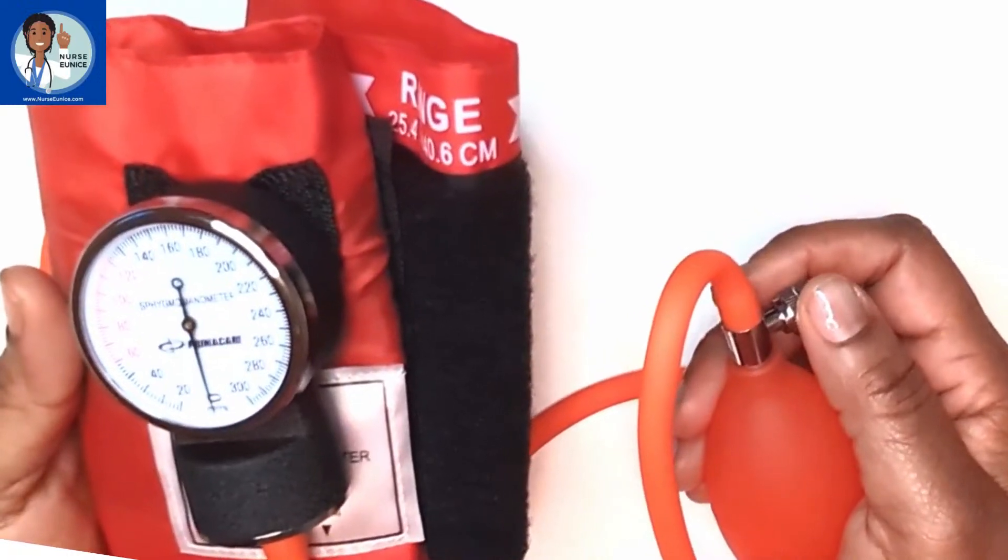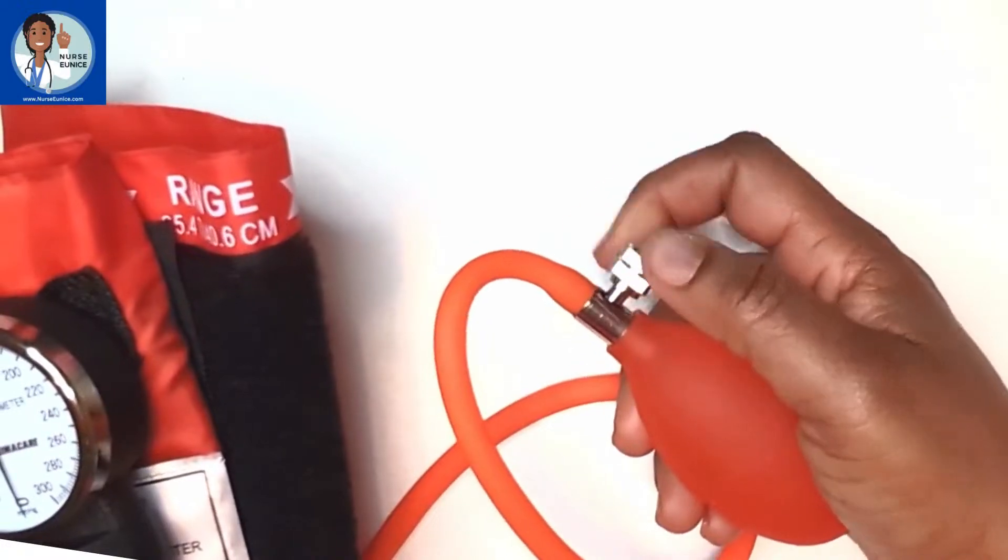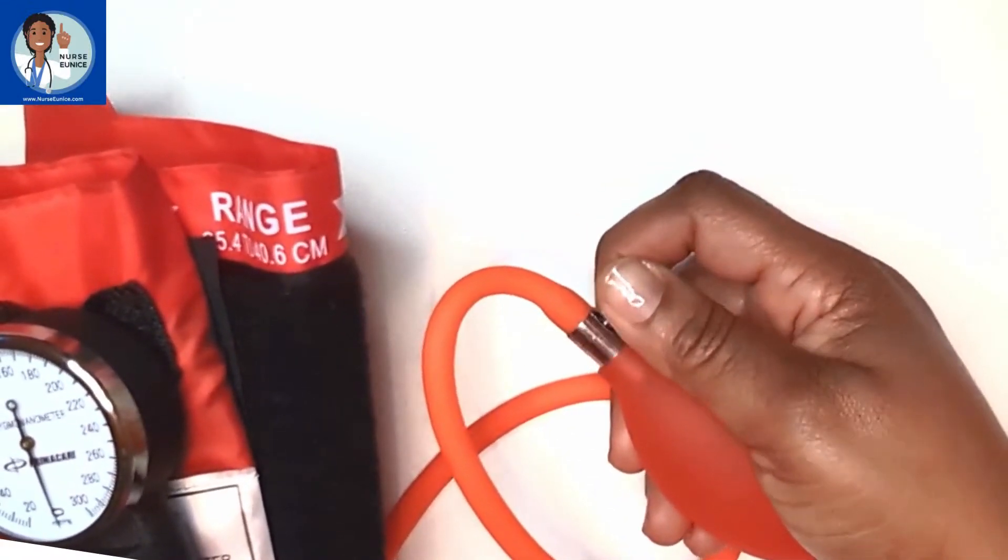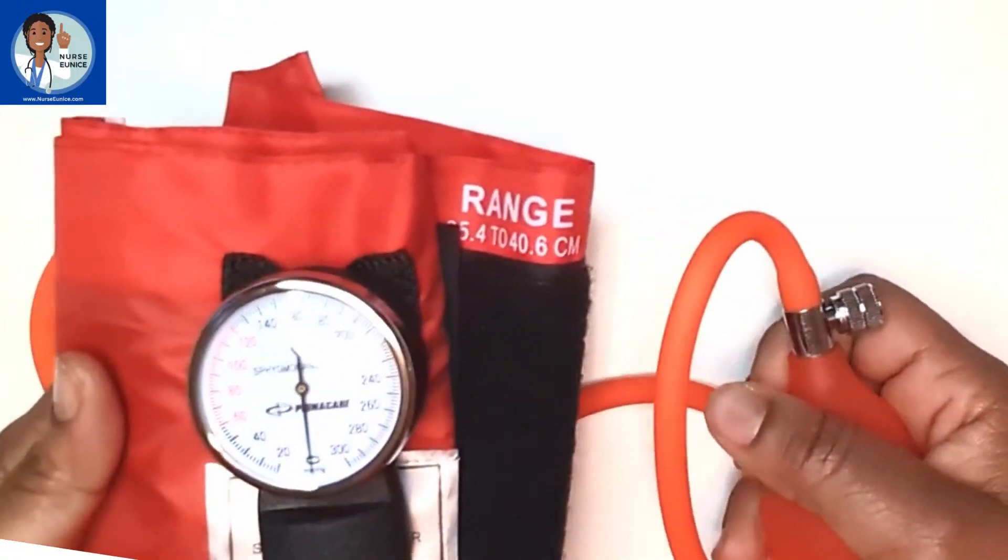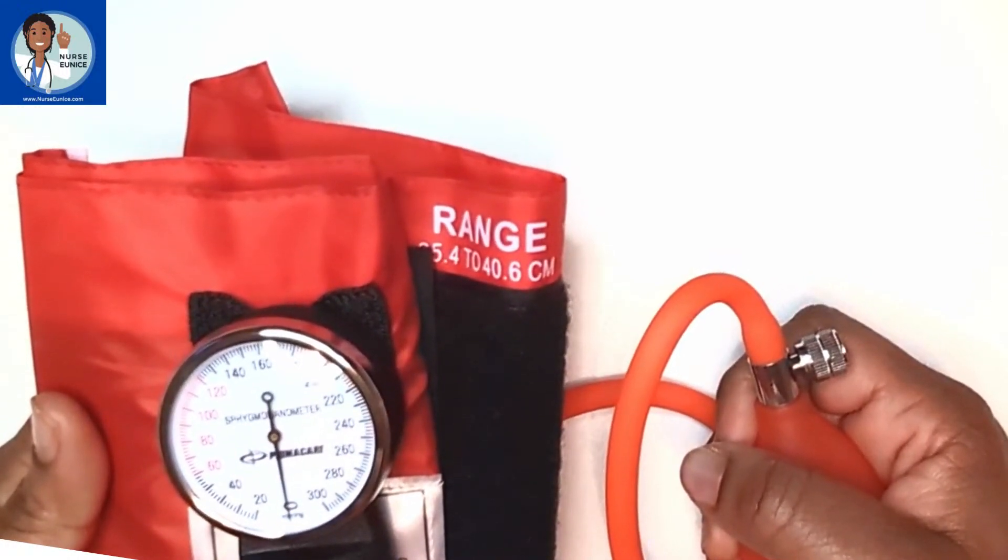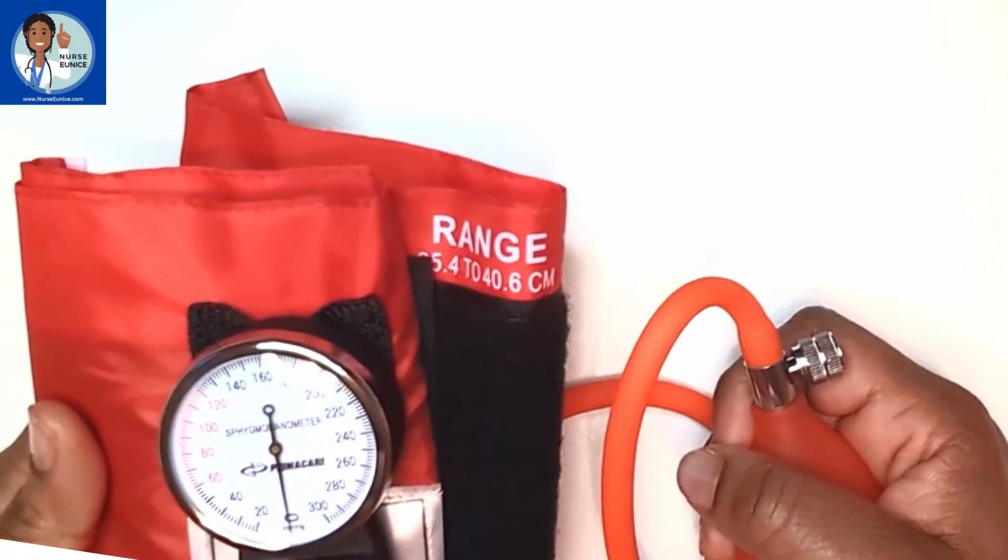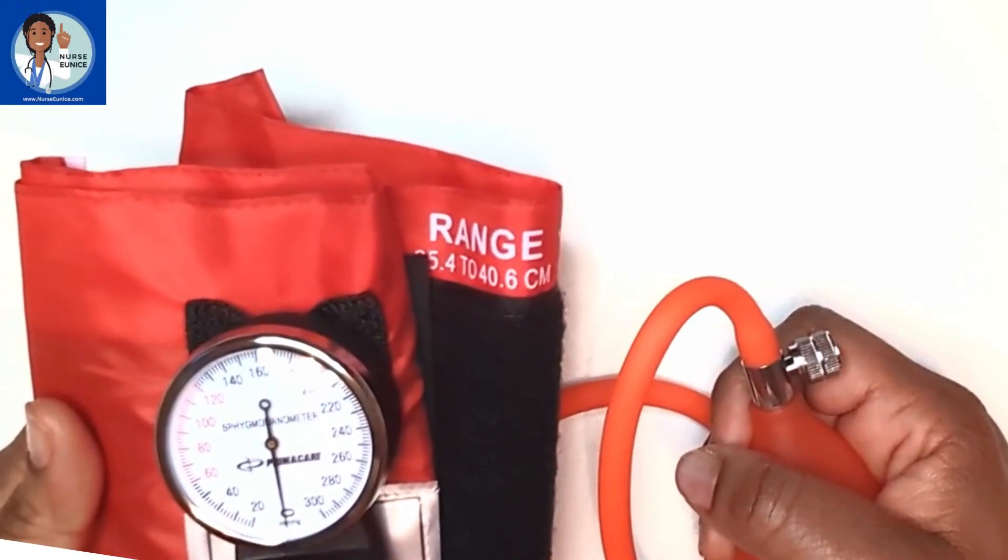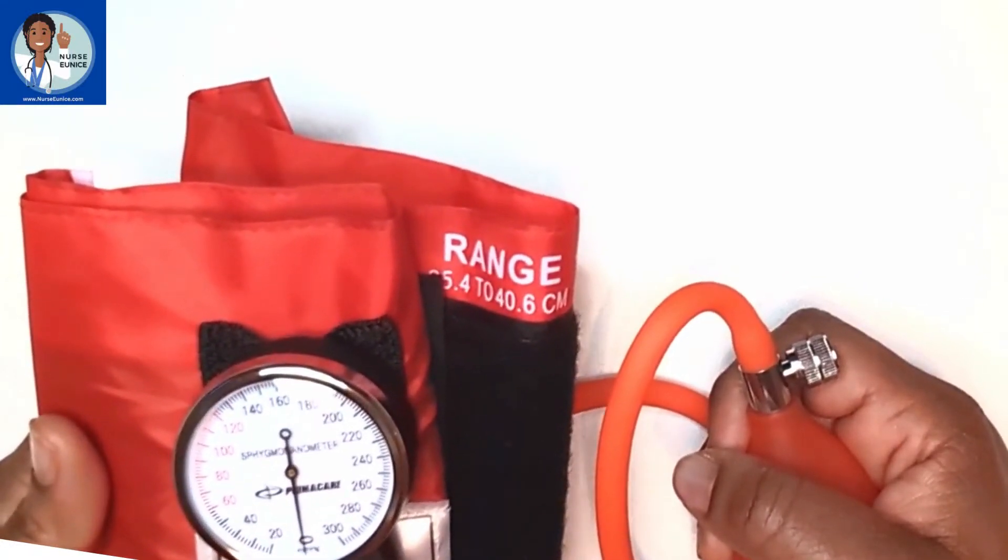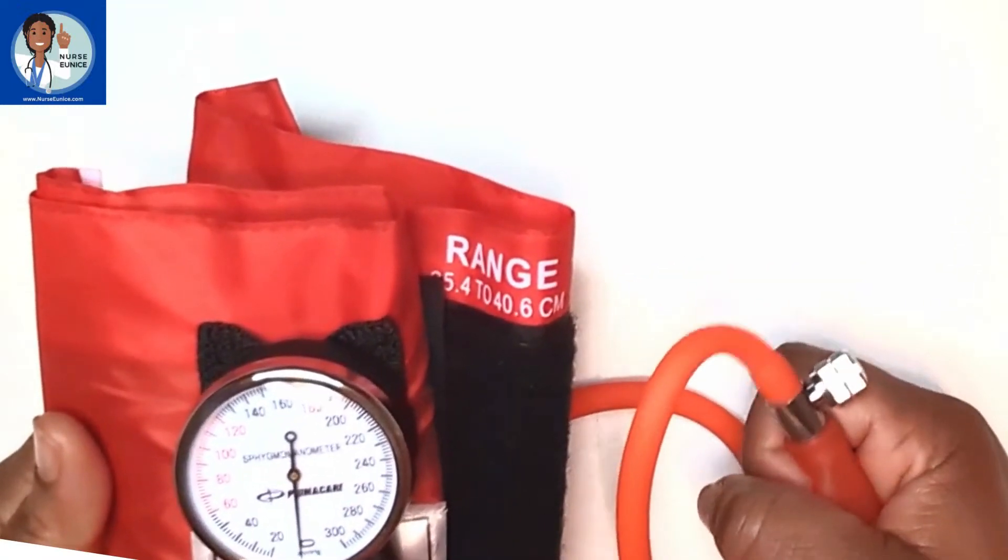Let's practice once more. What do I need to do to my air valve? I'm going to turn it away, close it, but not make it so tight until I can't open it with my two fingers. Once it's closed, you can do the two-step method where you feel the radial pulse and inflate the cuff until you no longer feel any pulsations and go 30 above that number. Or you can just inflate the cuff to about 150 if it's someone who does not have a history of hypertension. If they have a history of hypertension, you may have to go to 180 or 200.